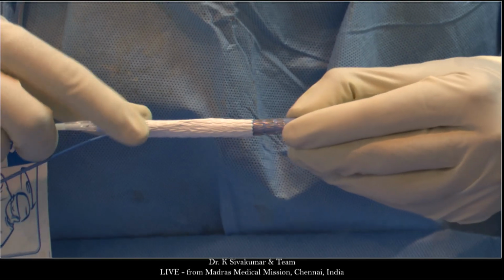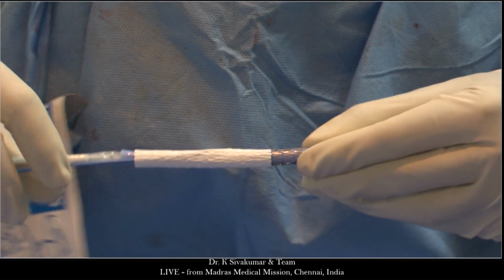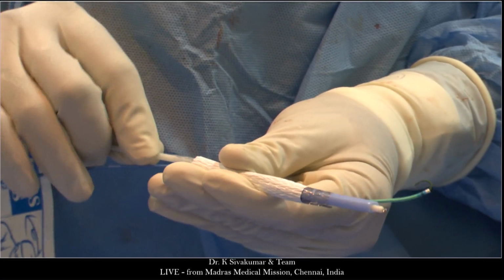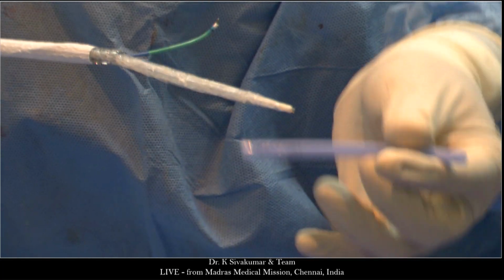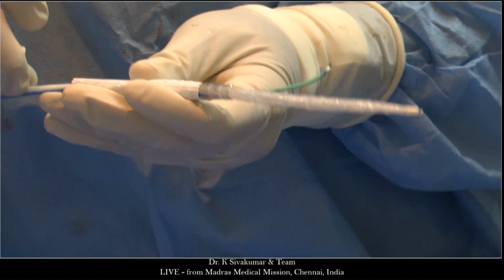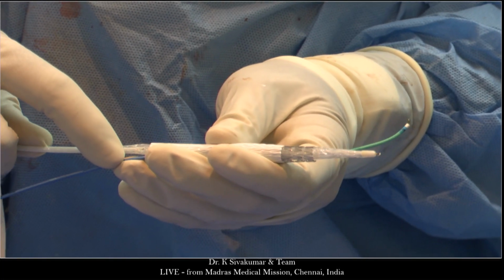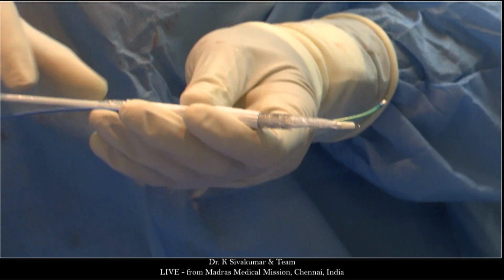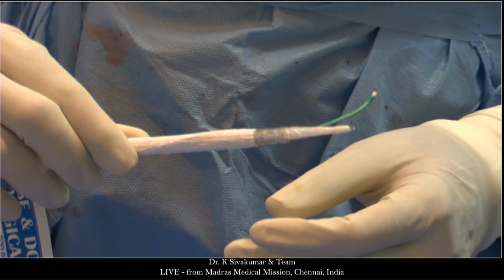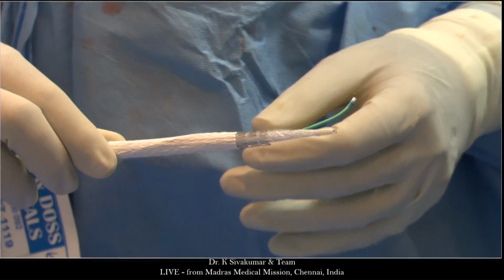I am peeling off the sleeve. So the sleeve of the balloon is peeled off. I get the balloon centered. So this is an 8 centimeter long Z-Med balloon, the same balloon that we did the balloon testing.